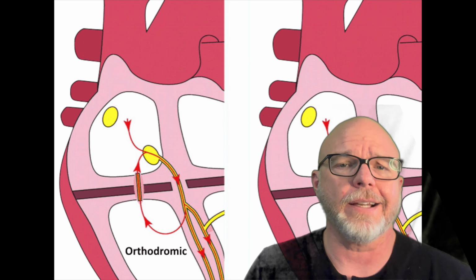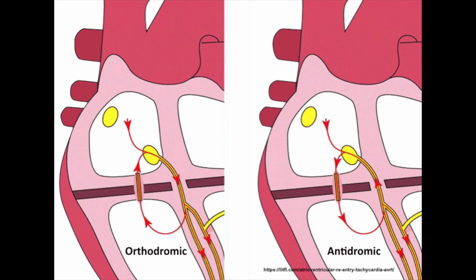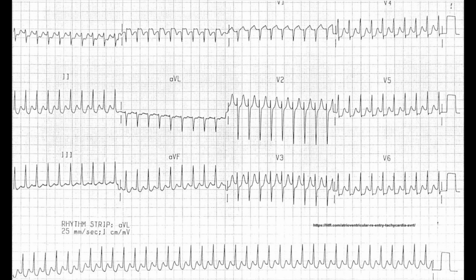Wolff-Parkinson-White syndrome, and I think other syndromes of pre-excitation, are associated with tachyarrhythmias. Ventricular depolarization can re-enter the atria and depolarize the atria again and get in a loop where it goes through the ventricles, up the ventricular wall, back into the atria, back over the AV node, down into the ventricles again. It creates a loop for that tachyarrhythmia, and that's called AV reciprocal tachycardia. It's one of the reasons to have SVT. That arrhythmia, even though it's temporary and you didn't catch the actual tachyarrhythmia on your EKG, can end up being one of the causes of syncope.